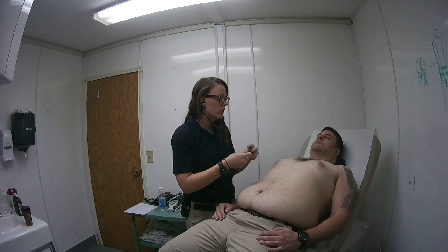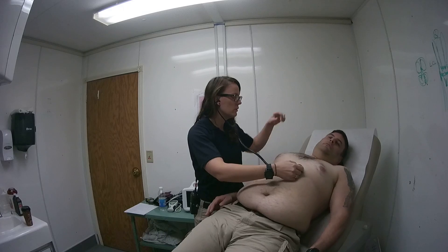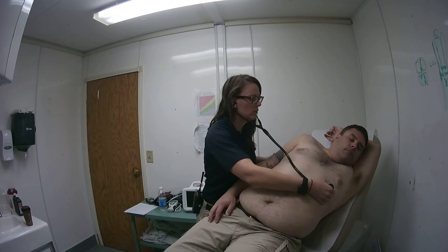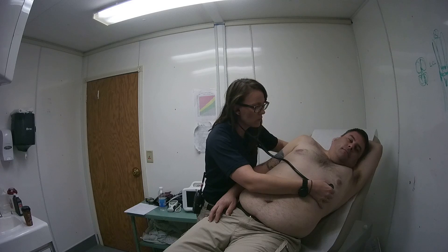Sometimes you can hear it better when the patient is left lateral decubitus. If you could take your left arm above and lean a little bit more to the left — perfect.